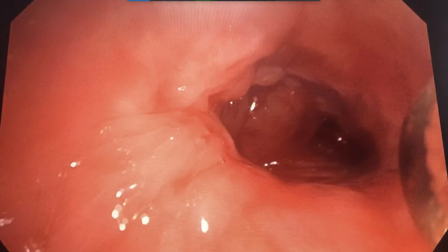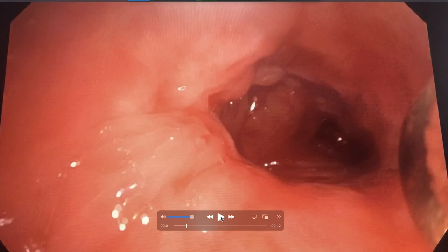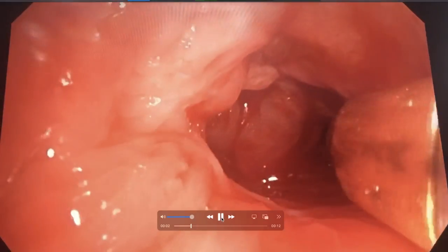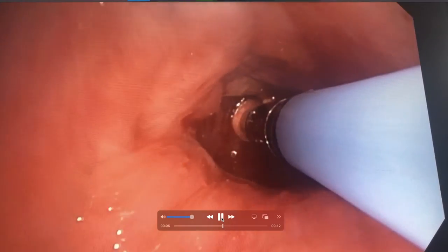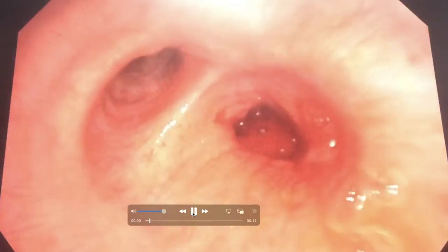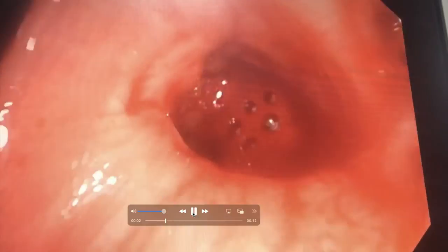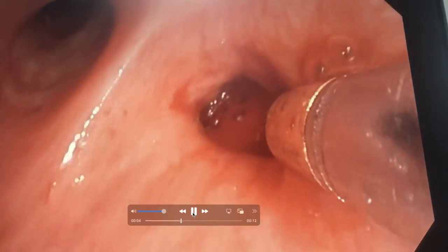The first step is to remove the granulation tissue. To do that I'm going to use the cryoprobe to resect it away. The cryoprobe freezes the tissue and I can just pull it away and remove it — it just got a bit stuck on the side of the airway there. We'll look in again — there's a little bit of blood — but we'll continue using the cryoprobe to remove that granulation tissue, then remove it through the rigid bronchoscope.